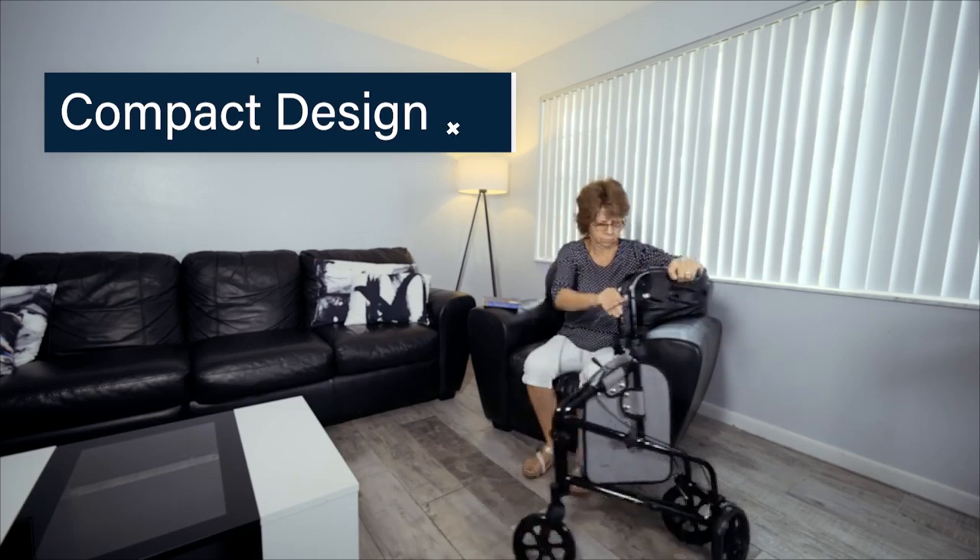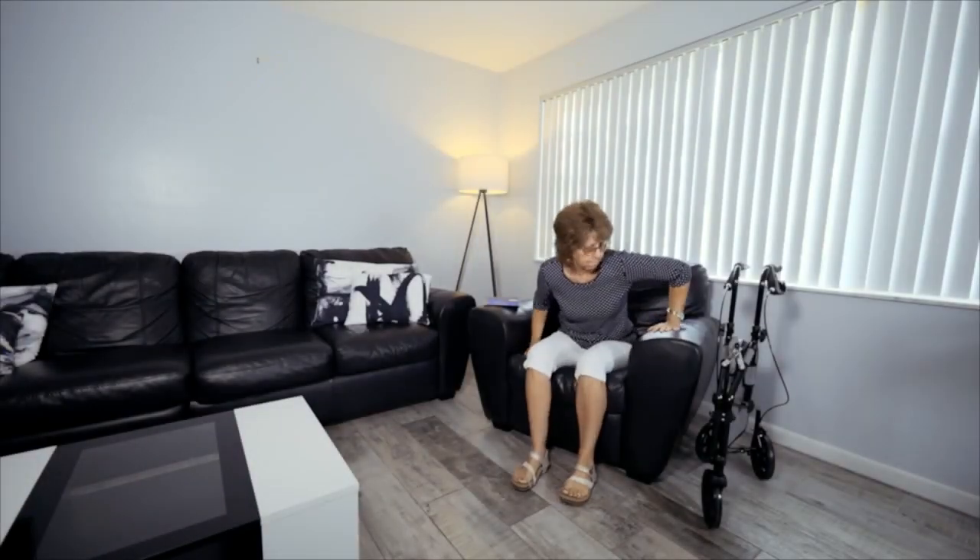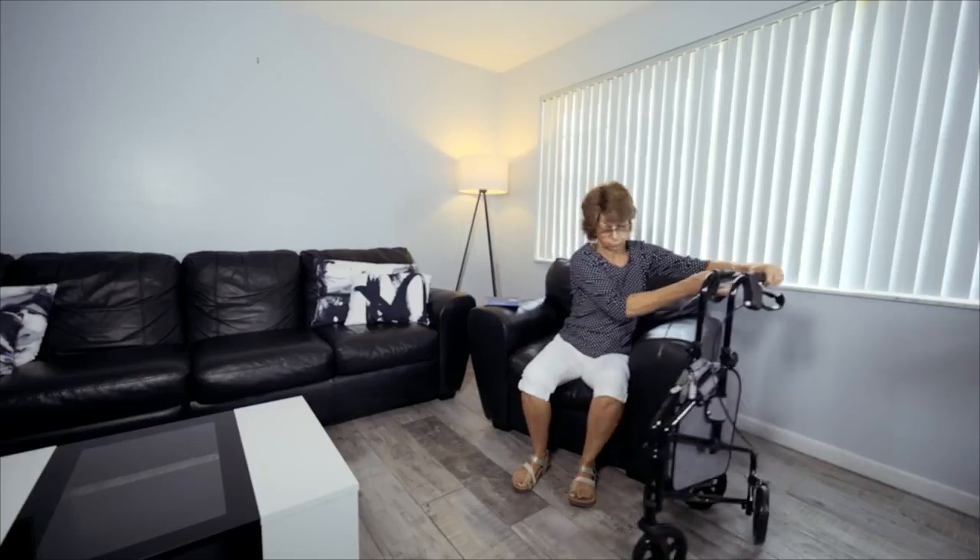With the ability to conveniently fold up for compact storage and easy portability, the Vive three wheel Rollator is out of the way until you need it.